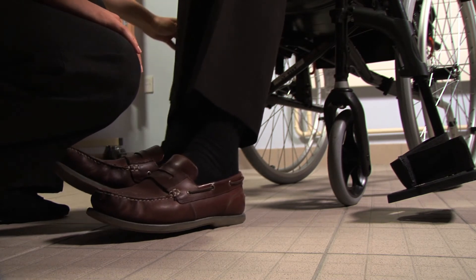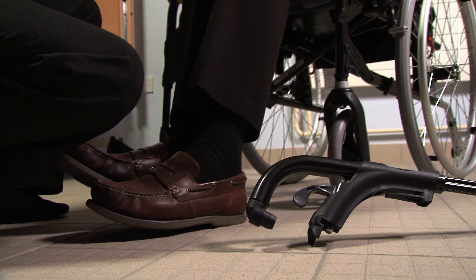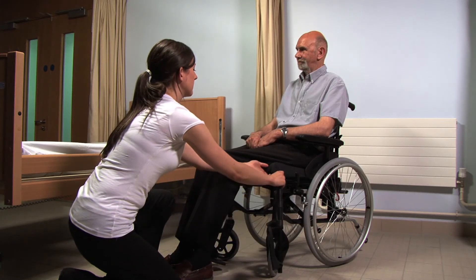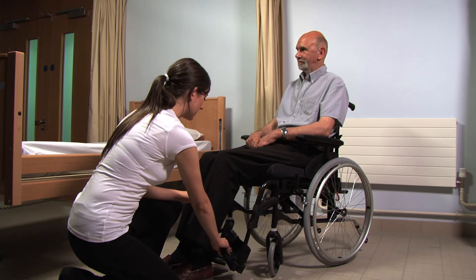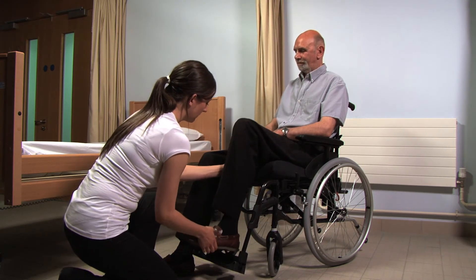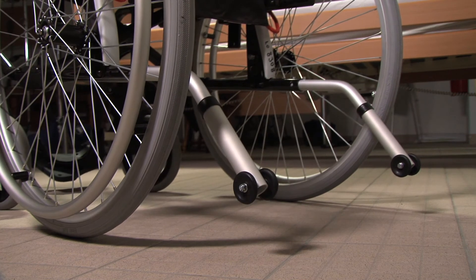If additional space is needed, the footplates can be removed entirely by lifting them from the frame of the chair. To replace the footplate to the main frame, swing it back into place and ensure that the clip is fully closed. The footplate can be flipped down and the wheelchair user's foot guided back into place.